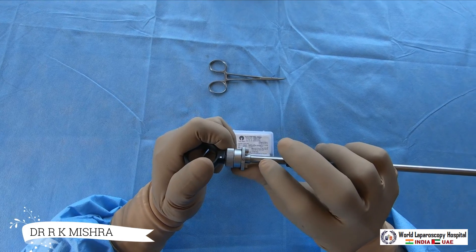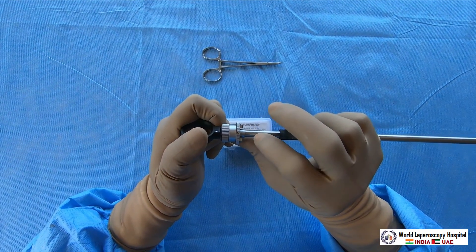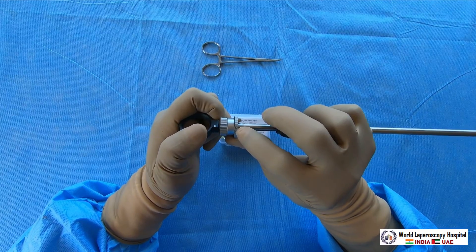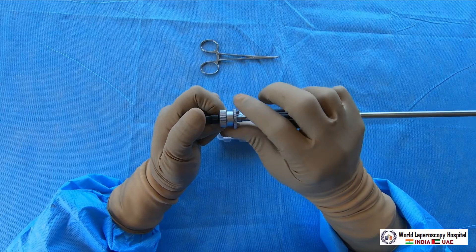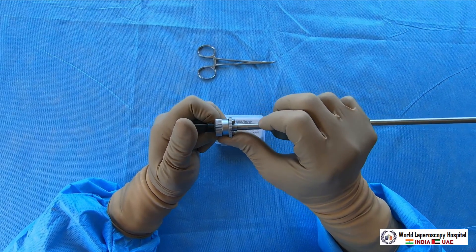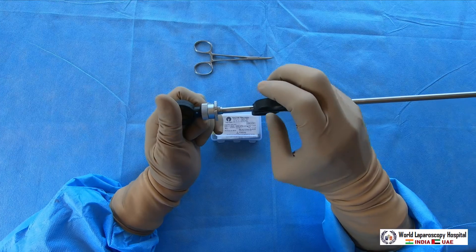Here there is a very important structure called the ring selection delivery collar. There are two positions: position number one and position number two. If you look very carefully, number one and number two are written on the instrument. If you are using two fallop rings together, at the time of firing the first ring you should keep it at number one.